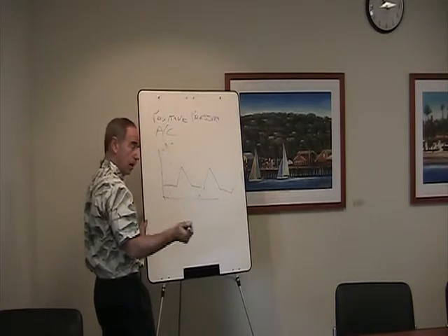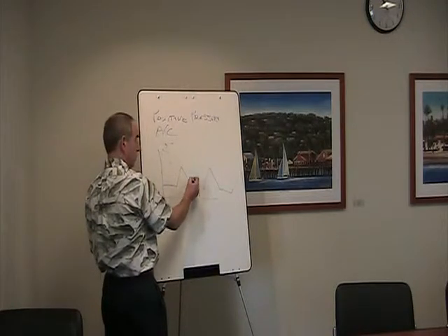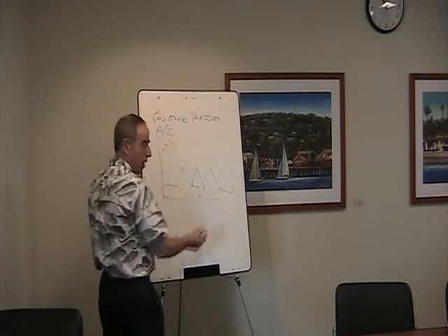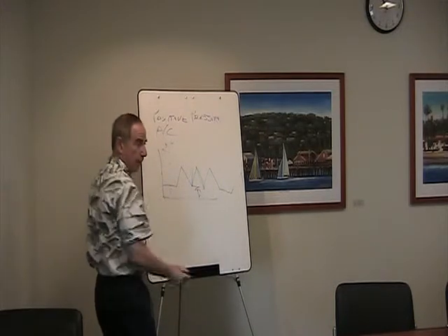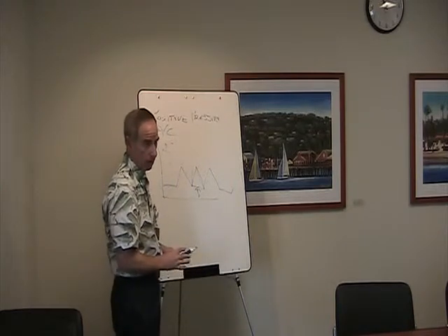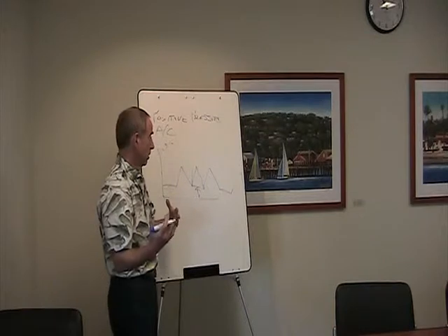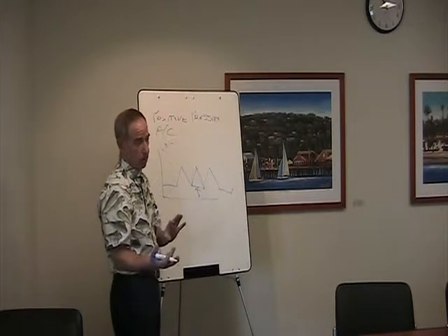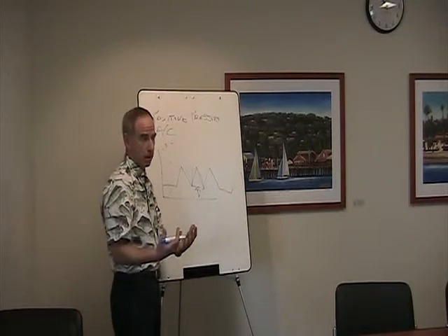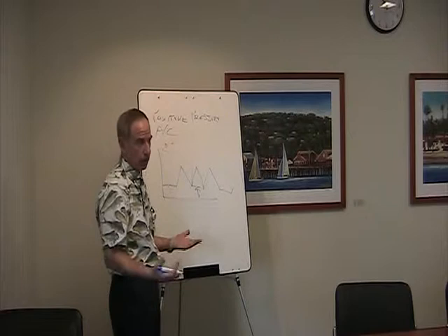So, yeah, in AC, you can get a breath. And if it's in a pressure cycled mode, you'll get the same pressure that you have it set at if the patient takes a breath here. They'll get a full breath, whether it's a pressure breath or a volume breath, depending on what mode you're using. So this was a big advance because now patients who are awake could actually take a breath and kind of help regulate their minute ventilation, which they can't do under CMV.